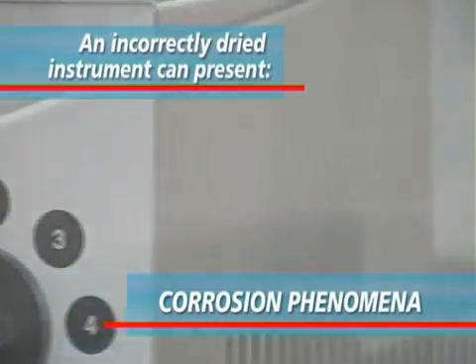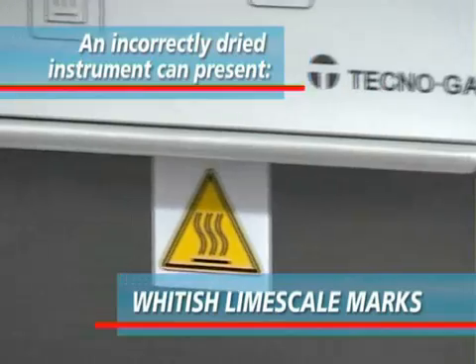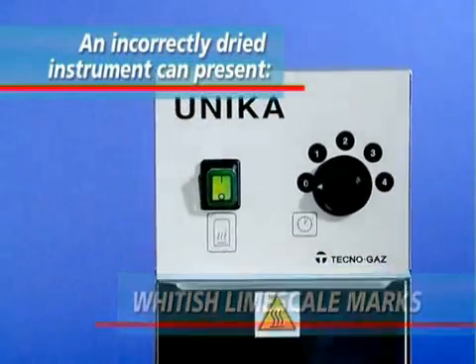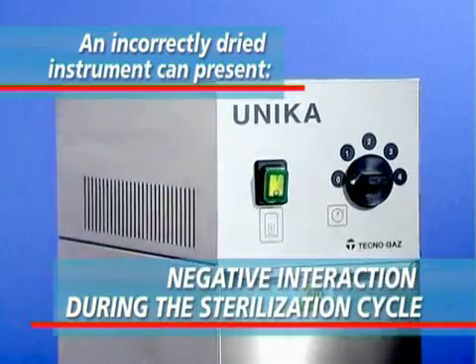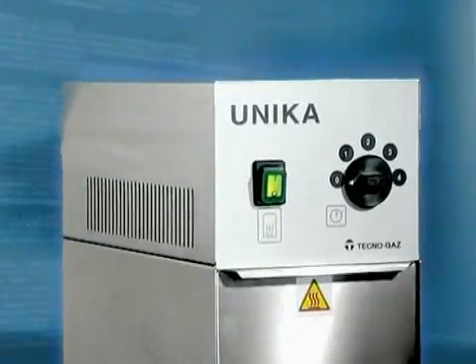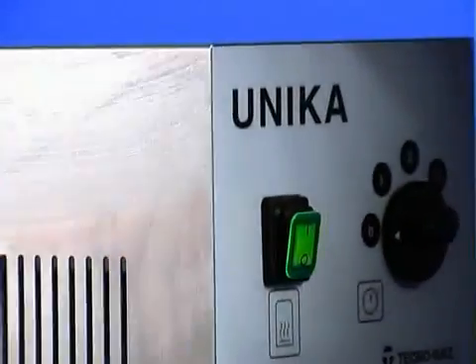Fenomeni di corrosione e di macchie giallastre sugli strumenti. Macchie biancastre determinate dalla cristallizzazione del calcare presente nell'acqua di risciacquo. Interazione negativa sul ciclo di sterilizzazione per eccessiva presenza di vapore. Completate il vostro sistema di sterilizzazione adottando questa importante apparecchiatura. Tutelerete voi stessi e i vostri strumenti.